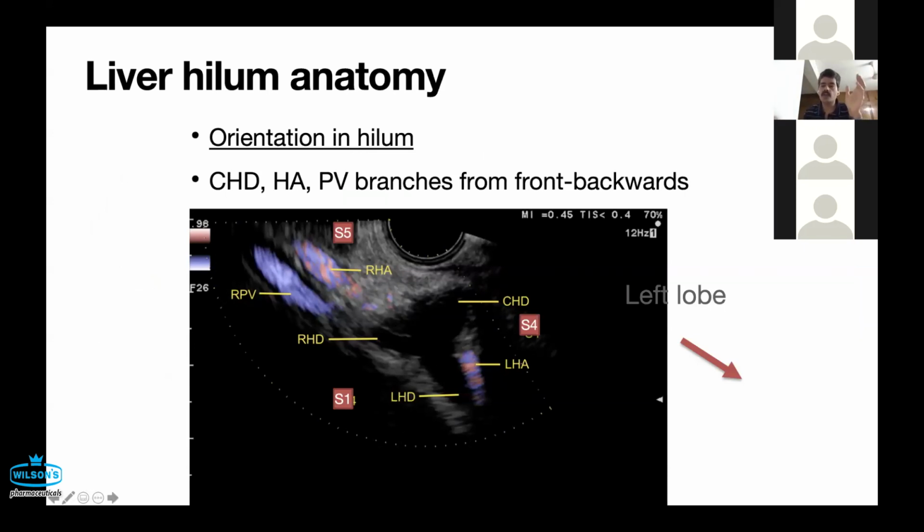This is a very important demonstration for Mirizzi syndrome, gallbladder neck pathologies, hilar cholangiocarcinomas. So all EUS people should know how to image the hilum from the duodenal bulb. You enter the duodenal bulb, inflate the balloon, put the big wheel a bit down, and just let your wrist drop on the left side so that the probe looks up. And this is what you will see, like the CT scan.